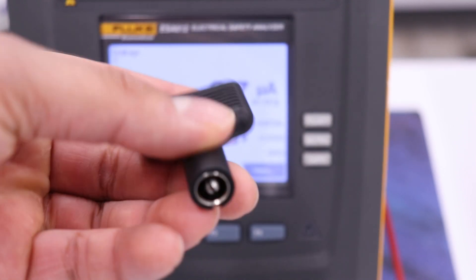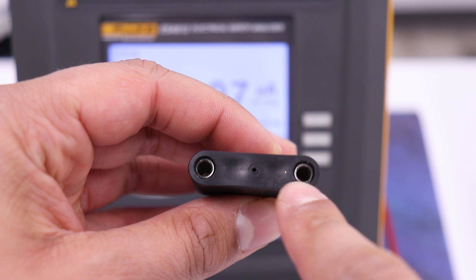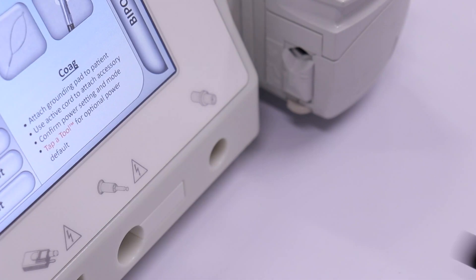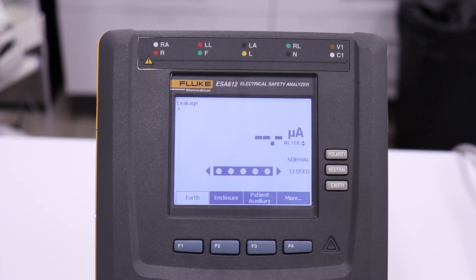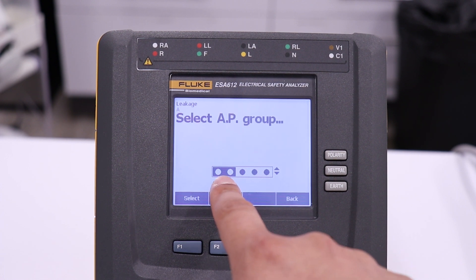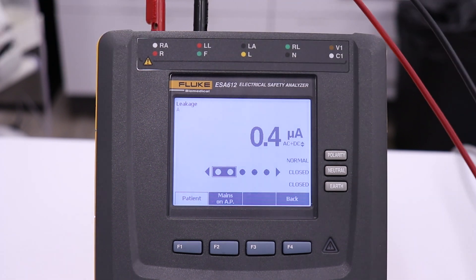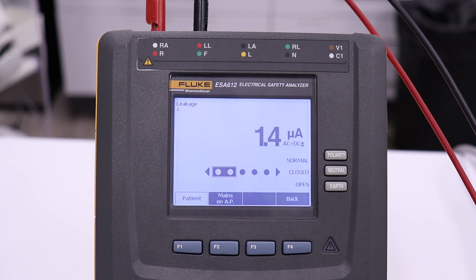The bipolar test adapter divides the active and dispersive lines within the bipolar circuit. Plug each end of two separate 4mm test leads into the bipolar test adapter. Plug the bipolar test adapter into the bipolar receptacle on the GI-4000. Go back to the leakage menu on the ESA by pressing F4 and then F4 again. This time, we will select the first two applied parts since we are testing with two separate leads. Plug both test leads into the first two receptacles on top of the ESA. Test for normal polarity, closed neutral condition, and single fault, open earth condition.